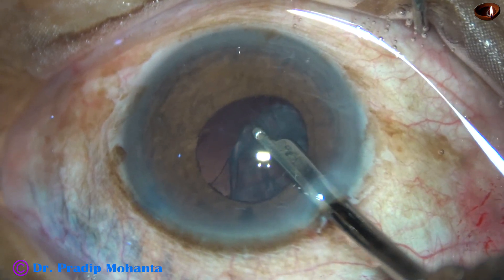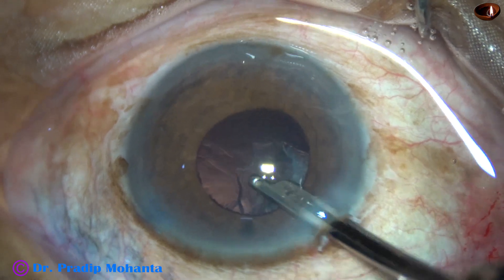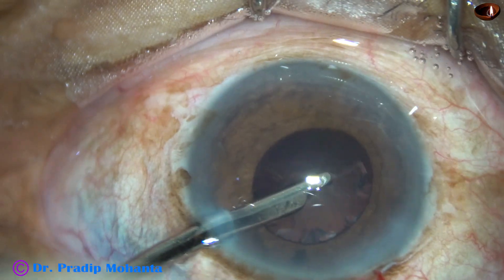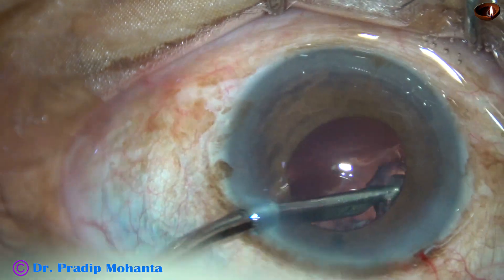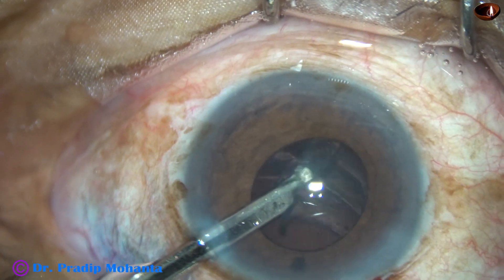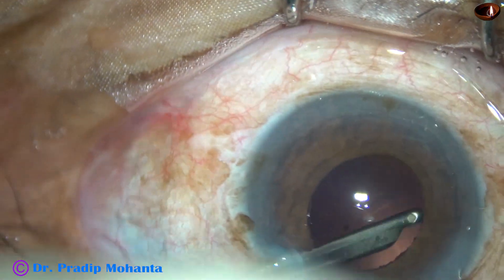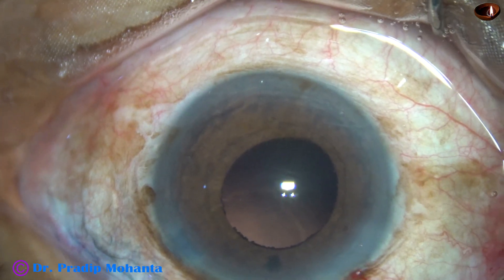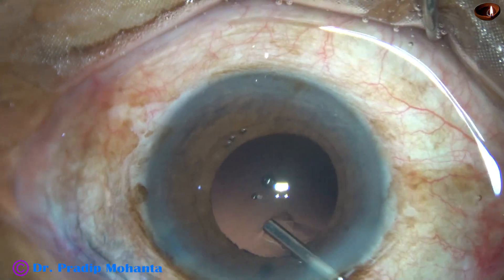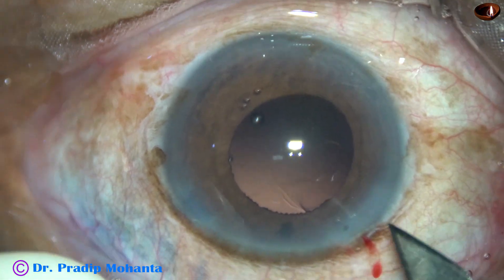We must not touch the iris. We must go in the bag and catch hold of the cortical matter and not catch the pupillary margin. So most of the cortex has come out. This is the last chunk of cortex. The cortex is nicely cleaned. But in such cases, we should check if there is any cortex retracting the iris after implanting the intraocular lens.